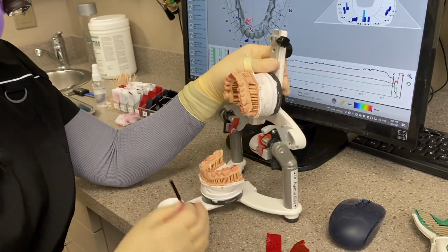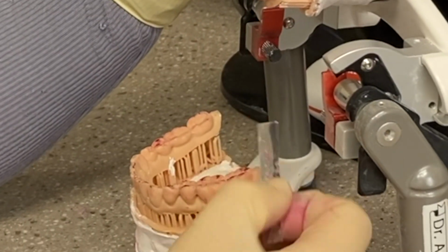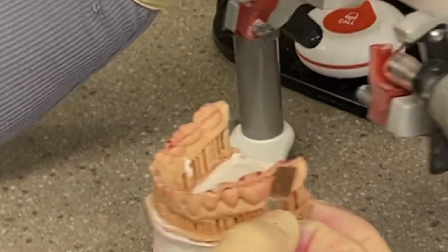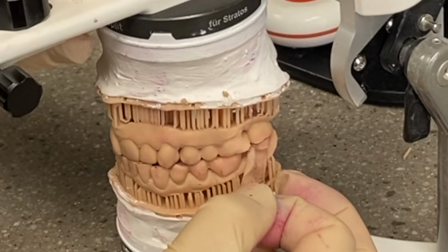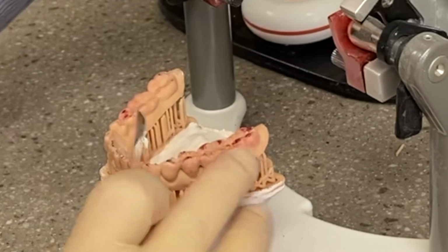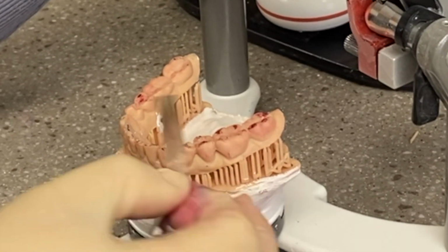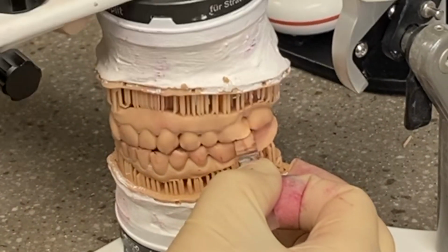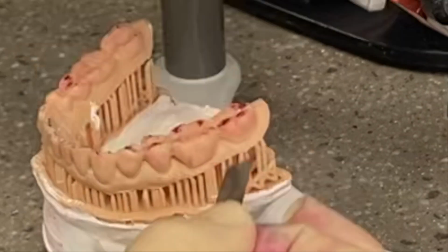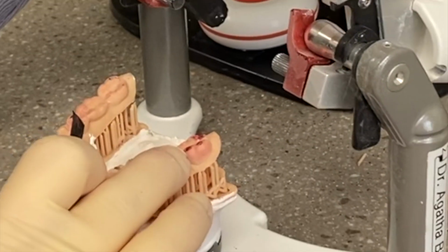Another way to check with shim stock, if you've got say 3, 4, 5 contacts you're not sure about, you position the shim stock just over the one contact. So just the tip of it over that distal buccal cusp, and then it comes out. So you know it's not that last cusp. So you know it's not this cusp when I test this cusp. So now again, I'm just gonna slightly cover that one spot, and I felt a tug. I really felt a big tug, okay? So we know it's that one.